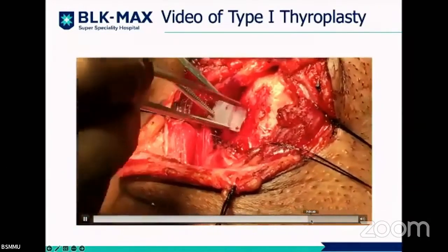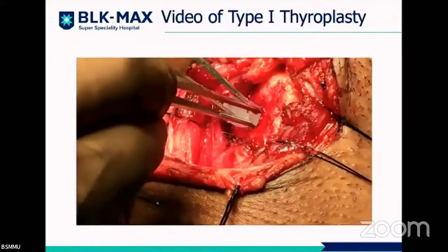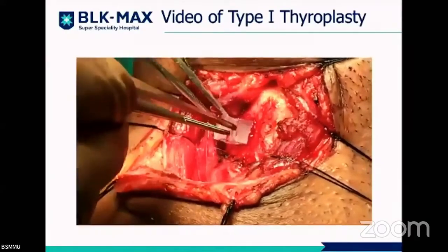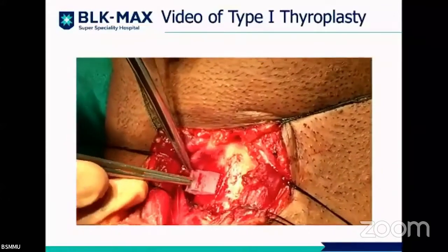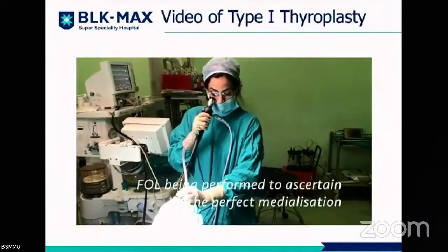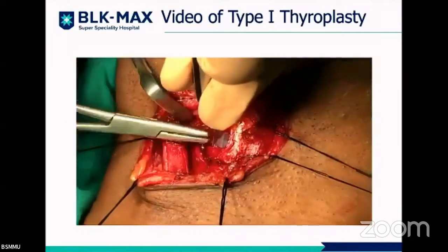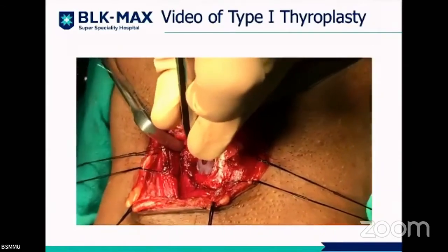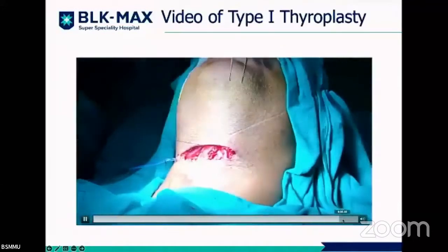So here we are putting it in, and the anterior portion is actually 2 mm because we don't want to medialize the anterior commissural area too much. It will create strain in the voice. So it's being inserted, first posterior and then anterior, then you push in the entire middle portion. Once this is done, we check the vocal cord position. This is now in position. We use the fiber optic laryngoscope to visualize the cord position. And once we are satisfied, we secure the implant with 3-0 Prolene so that it doesn't extrude. After that, the wound is closed in layers after placing a mini vac drain.